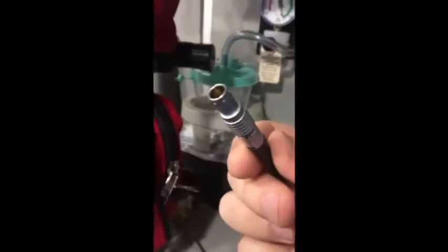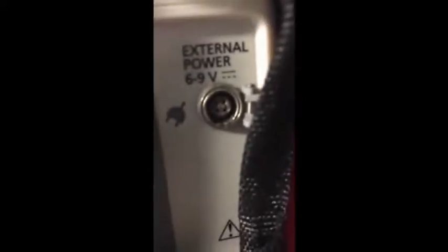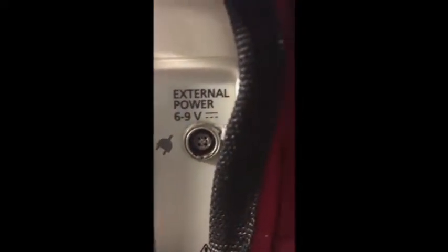So here we have the pump, which is sitting on the pole where it normally rests. You can see the two grooves on the bottom of the charging cable, and find the two grooves. And there's that red dot that sometimes is lined up and sometimes is not. This one happens to be on the bottom instead of the top where they typically are. And if we open the little latch, you can see the cable symbol that will turn green. So we're going to open this up and we can see the two grooves on the inside. A lot easier to do with your eyes than a camera. This one actually has a red dot on the bottom on the inside of there, I see. So this one, I guess, is technically labeled correctly.